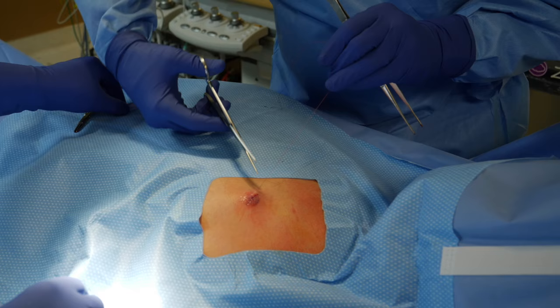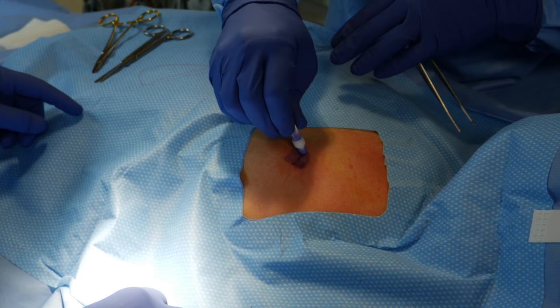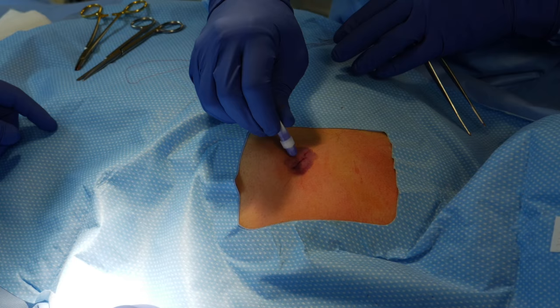When patients come into the office, we can download everything that has happened since the last clinic visit and discuss whatever rhythm issues the patient may have. The patient can report to the device when they're having symptoms, so we can do symptom-rhythm correlation to explain the basis of symptoms based on the associated heart rhythm.